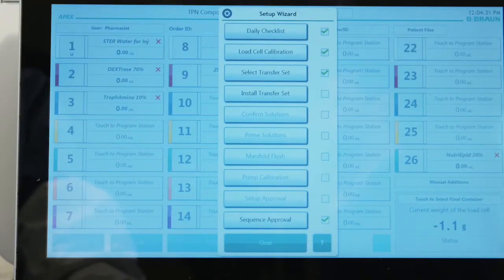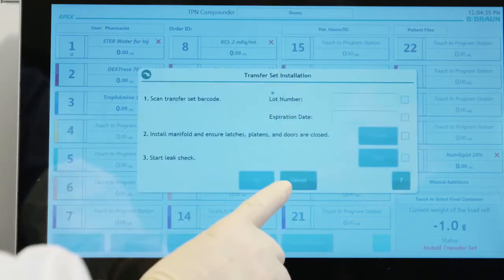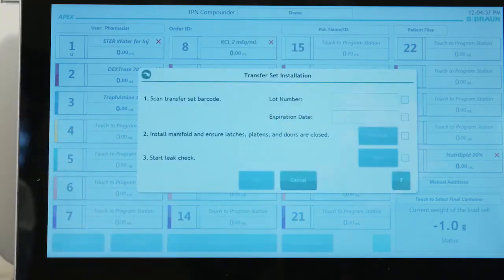To begin the process of installing a transfer set, tap Install Transfer Set from the Setup Wizard. The Transfer Set Installation screen will open.